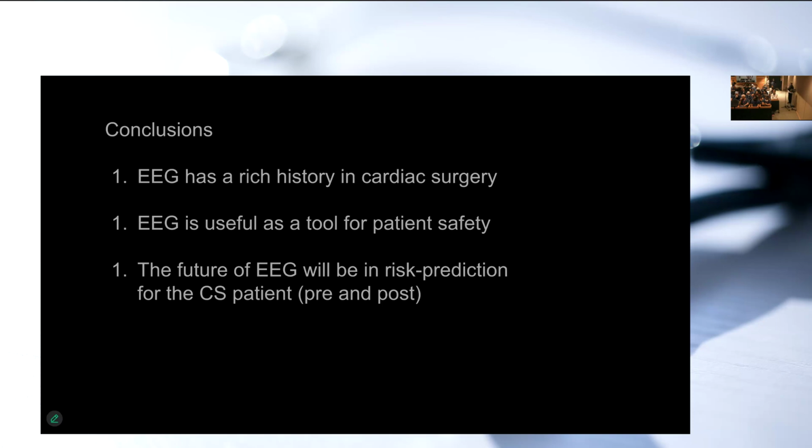Yeah, absolutely. So in fact, this is a simple mathematical problem, right? Taking the EEG and in real time assessing the EEG for the alpha power and tracking that over time is actually a simple mathematical problem. So it has been subject to machine learning algorithms since about probably 12 to 15 years ago. And there have been some very interesting little applets, which are not on any device you can buy, but if you have a computer in the operating room, you can use this stuff. But the short answer is yes, it has been the subject of AI with great and interesting value.